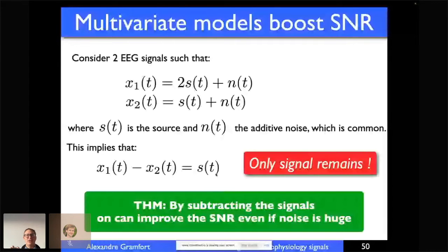Looking at a single EEG electrode and concluding that you have an effect of interest is probably not so real, or the effect could be made much stronger should you consider an analysis that leverages your array of sensors by doing linear combinations of your sensors.